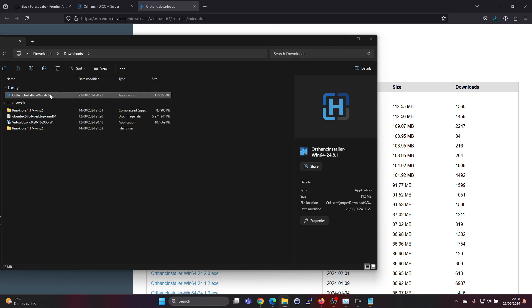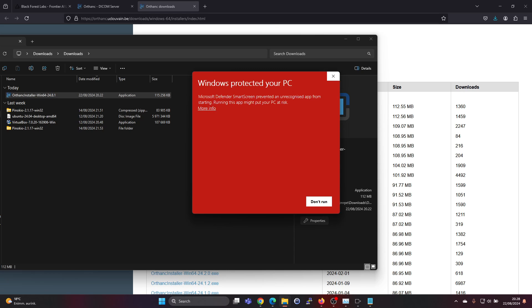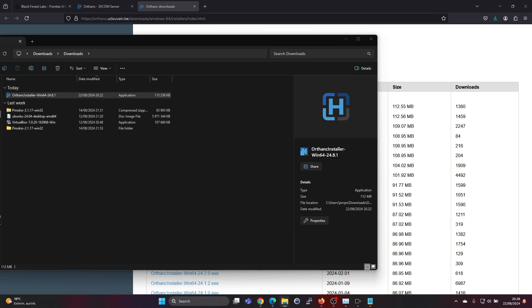Let's double click on the installer to get the installation started. Okay, we need to press run anyway.